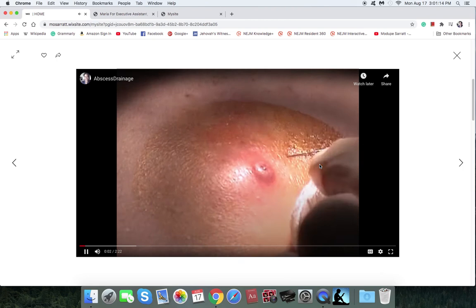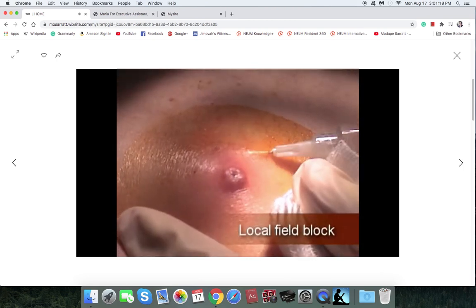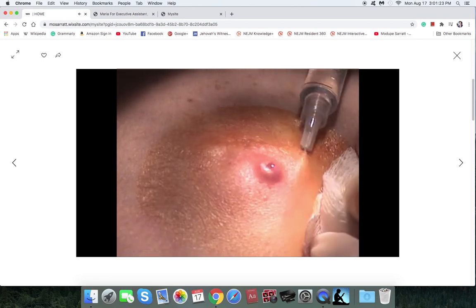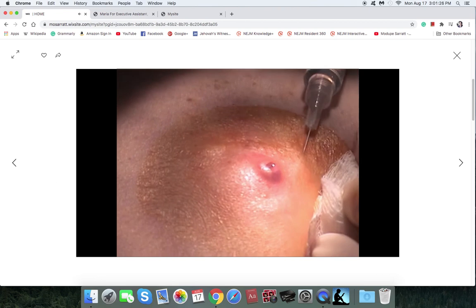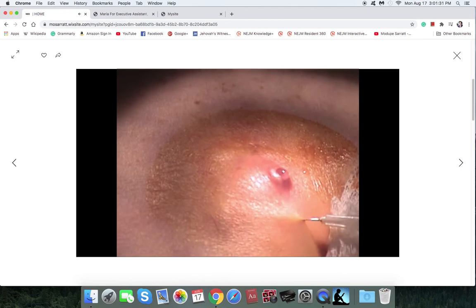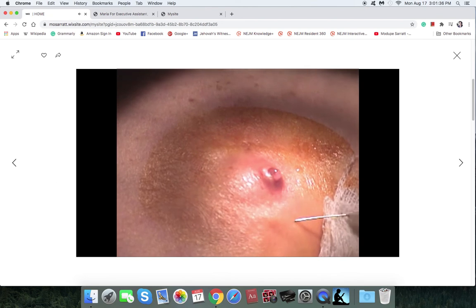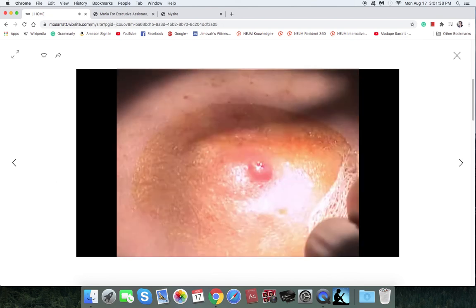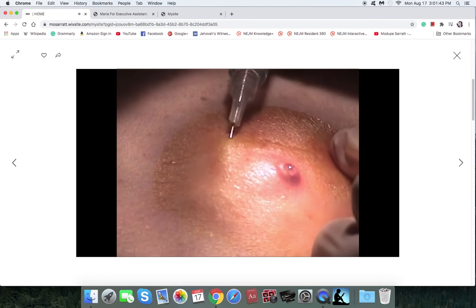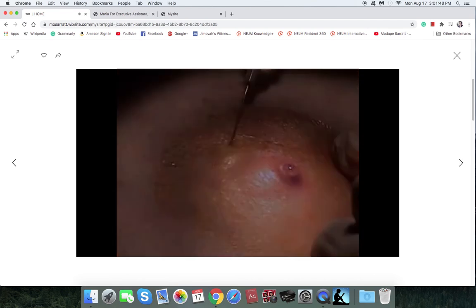Eye splash protection should be worn for abscess drainage procedures. To perform a field block, insert the needle at opposite ends of the area to be anesthetized. Pass the needle alongside the edge of this region and then withdraw it while anesthesia is injected. Reinsert, as shown, at 60 to 90 degrees to the initial block at the adjacent aspect of the first injection. After the initial half of the block is completed, anesthetize the opposite side to complete a diamond-shaped field block.